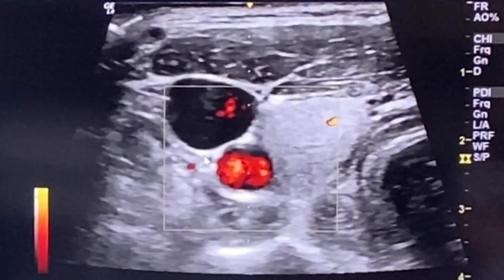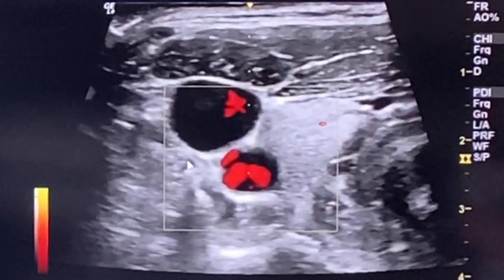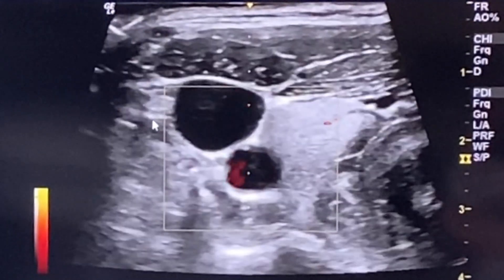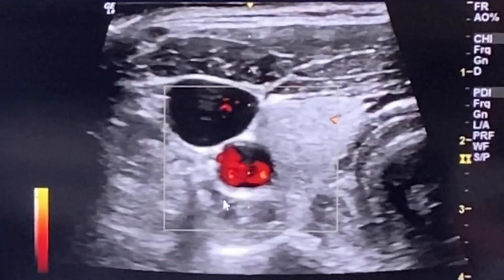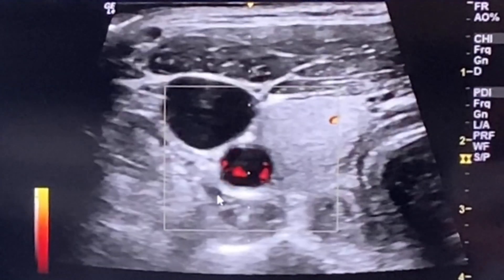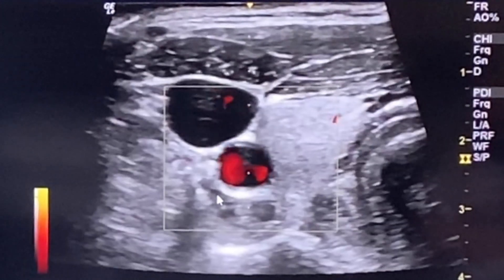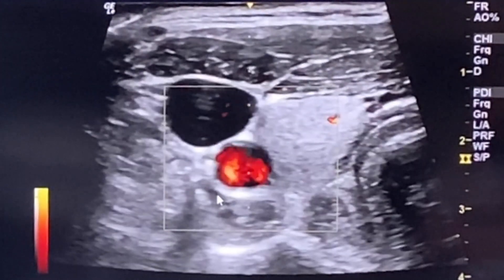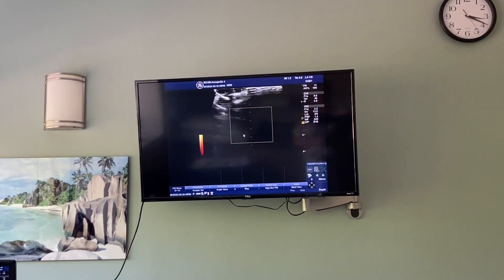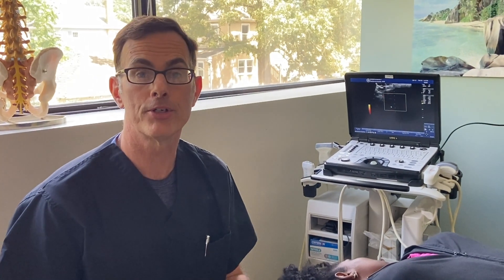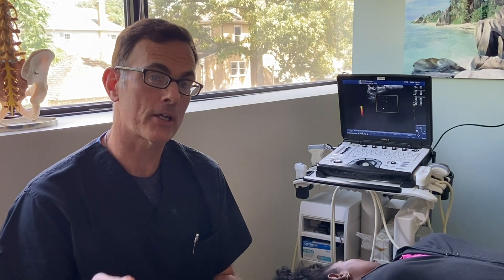Doppler imaging allows me to clearly delineate these structures so that when I steer my needle carefully away from them, I can avoid them and direct my needle to the target, which lies right about where the arrow is. I can then safely perform this procedure without worrying about critical structures in the way. This is really one of the biggest benefits of performing stellate ganglion block under ultrasound guidance. The other benefit is my patients are awake — they can tell me if something is painful, and I can slightly redirect the needle while looking at it under live ultrasound.